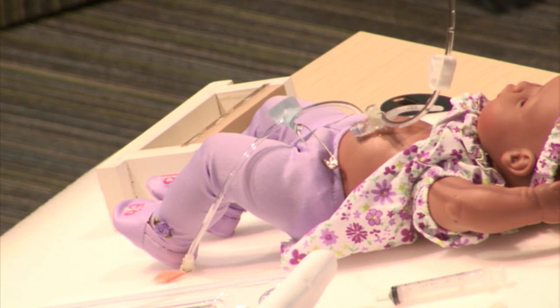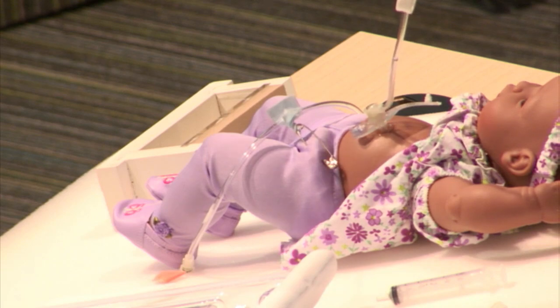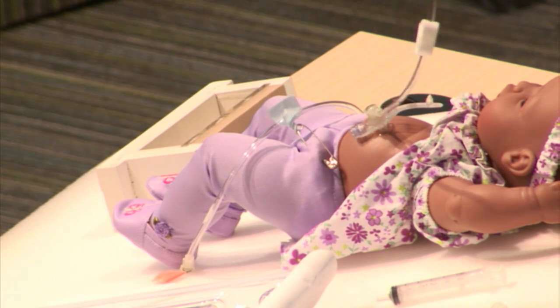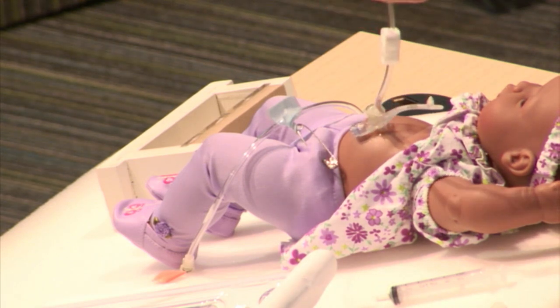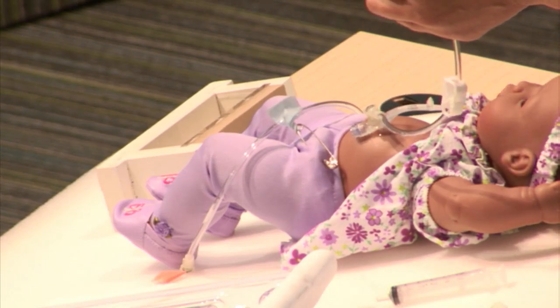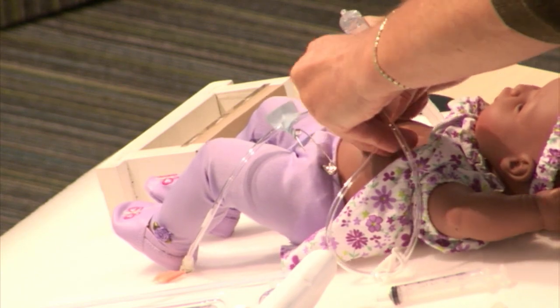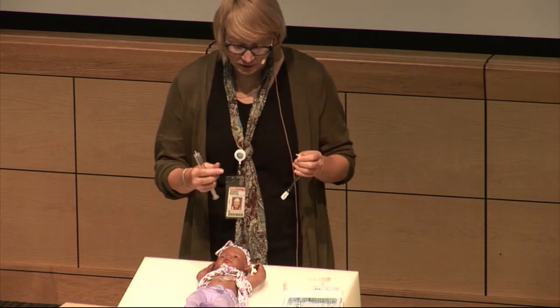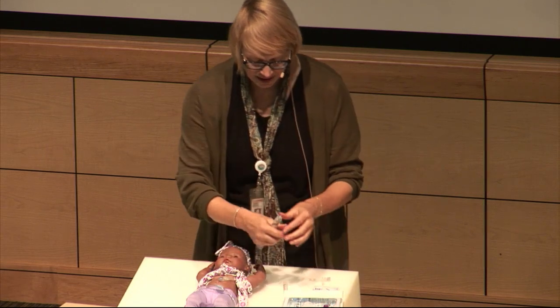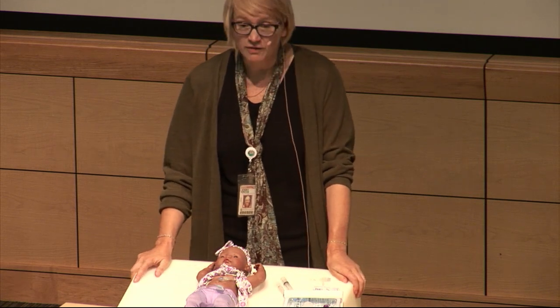What if it wasn't in the stomach? What would it feel like if it wasn't in the stomach? Well, first of all, you wouldn't be able to get the water to easily go in here. It would be like doing an IM injection. You'd have to push it in under pressure, so that's not normal. And also, if you're pushing it under pressure and then you can't get any feeding back, then you'd be really worried, and you'd have to send this kid to fluoro for a G-tube study to see where this tube really is. But luckily, it's a very safe procedure to do in the home. We have a very, very low rate of the tubes ever being displaced, and therefore it's super safe to teach parents how to do this at home, and they can feel very confident doing it.